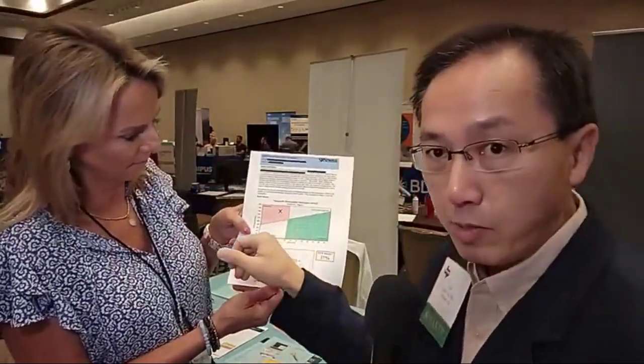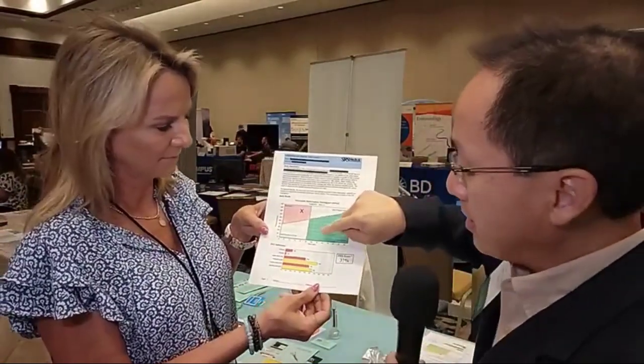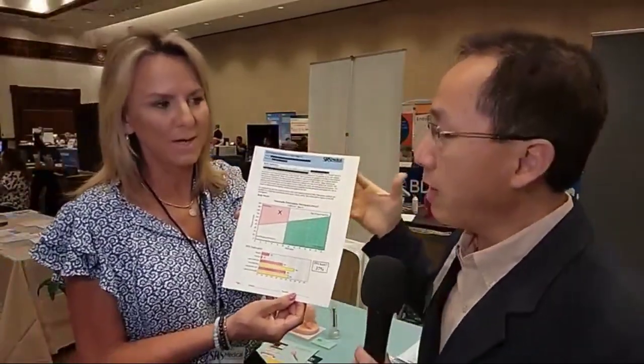Once the bladder completely decompensates, your bladder is no longer able to generate any pressure, and then your flow is very poor. That's the way I explain things to the patient — it goes from green to this area and then in that direction. This is the actual printout of the SRS report. Keep in mind that x is peak pressure and peak flow — so it's one moment in time as we capture that data.